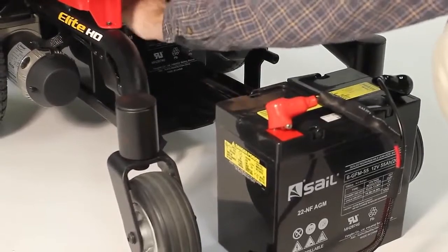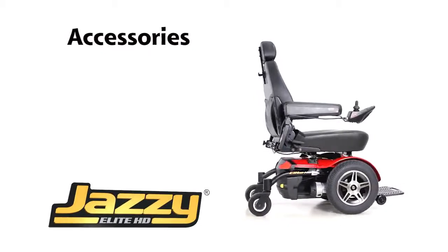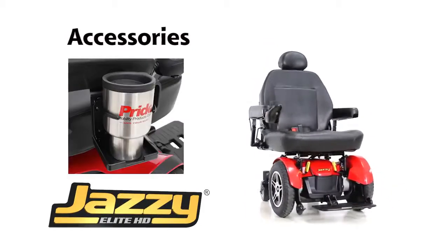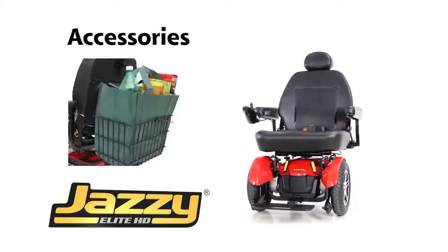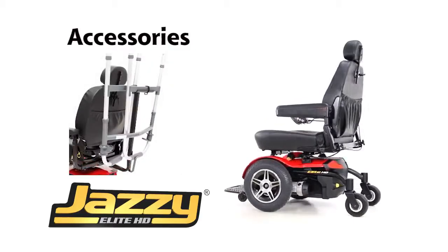The batteries quickly disconnect to remove them from the base. The following options are available on the Jazzy Elite HD: a high-back seat with solid seat pan, a cup holder, a weather cover, a rear basket, an oxygen tank holder, a cane and crutch holder, and a walker holder.